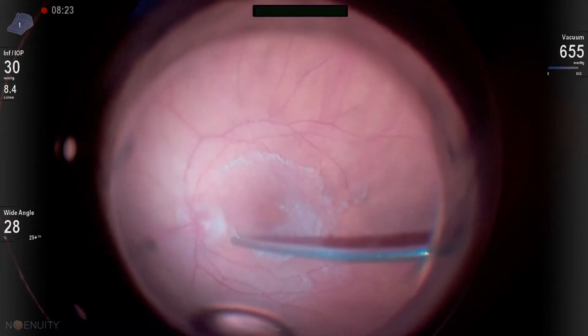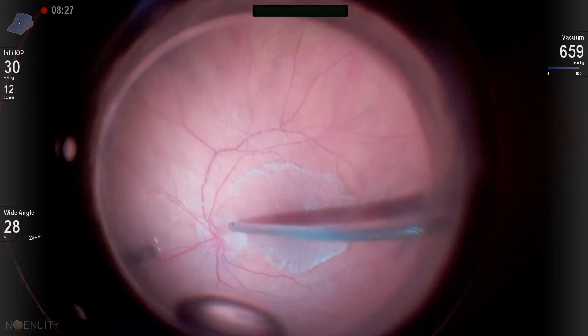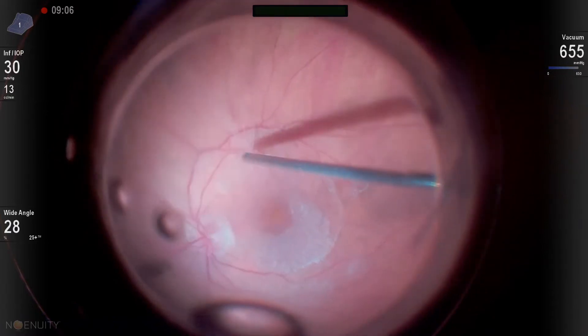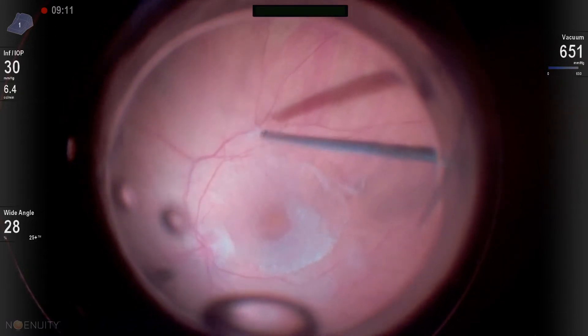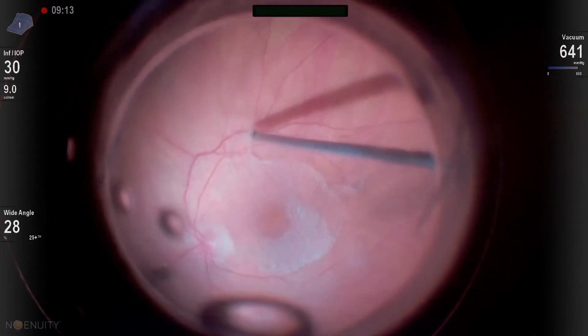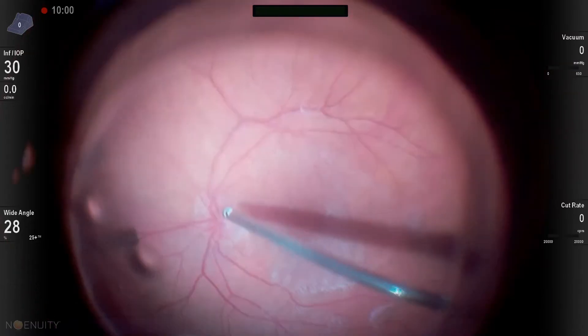If you peel over the nerve and you can't get it, do not do this maneuver. Do not try to peel over the macula — you're not going to be successful trying to peel out in the mid-periphery. Don't try these things because they're not going to be effective. I'm showing you really what not to do.